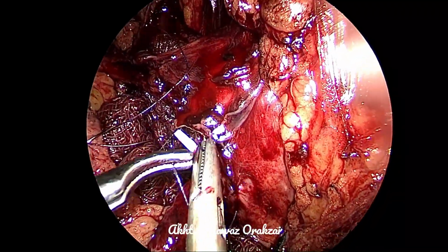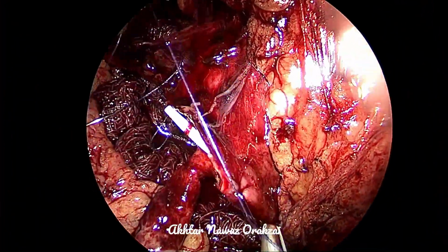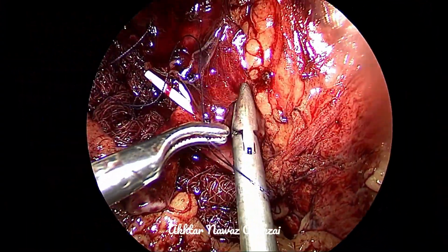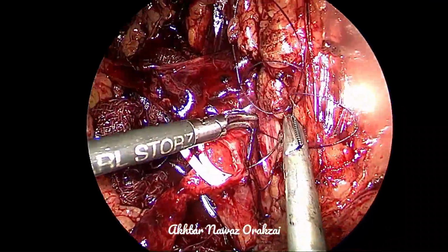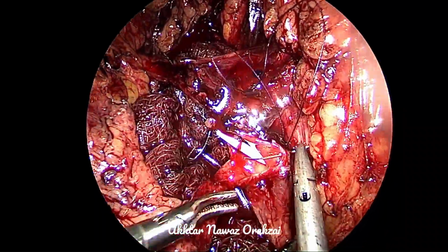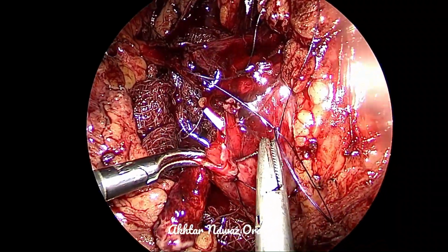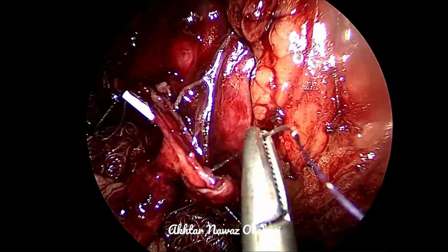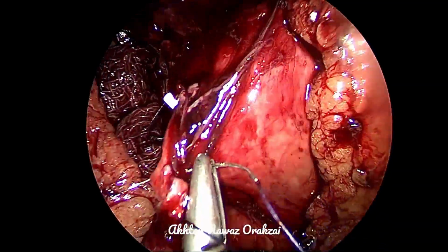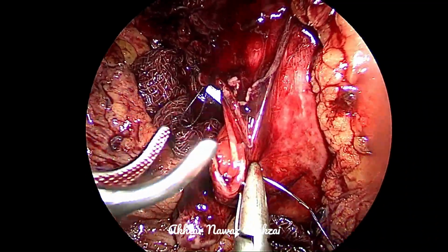as we are observing the principles of watertight, tension-free, good vascular supply, free drainage by the DJ stent, excision of the excessive pelvis, and in the end we will place a drain in the pelvis because it's a transperitoneal procedure, and we will place a catheter.